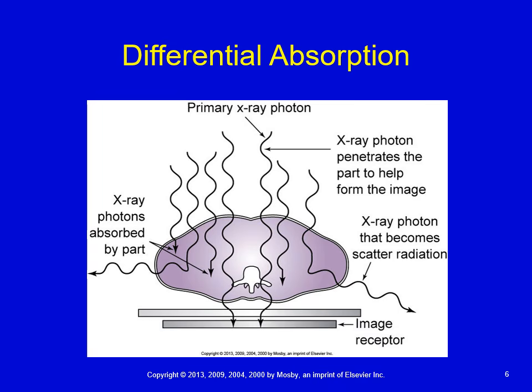So let's count the number of X-ray photons that went in. Just visually, there's about 1, 2, 3, 4, 5, 6, 7 X-ray photons that went in. There's many more X-ray photons, but visually speaking, 7 X-ray photons went in to create this particular exposure of the patient. Now, what actually came out was a whole lot less than 7.